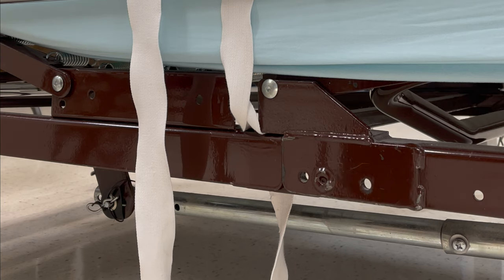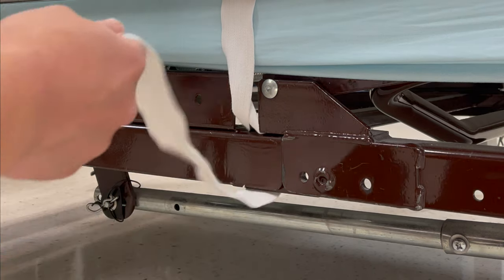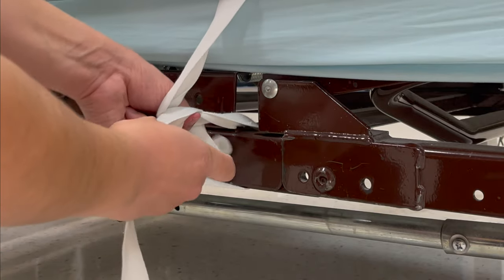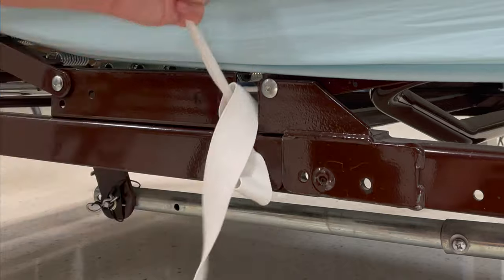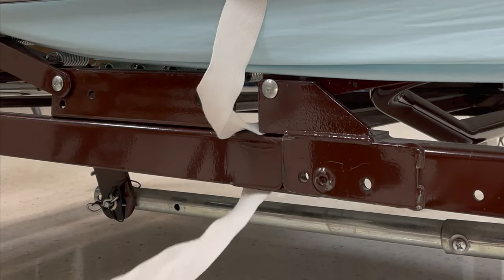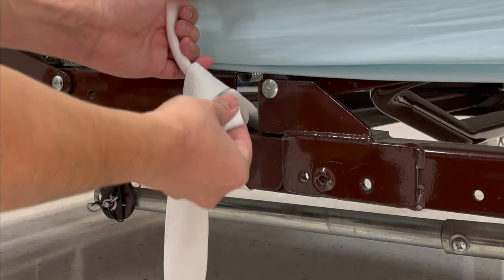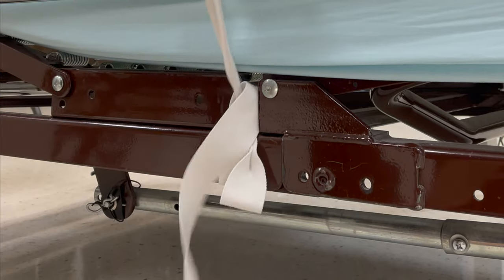When putting on a restraint, you want to make sure to put it in a quick release tie. You're going to create a loop in one hand, place it into the top hole, and then slide it into the bottom hole.